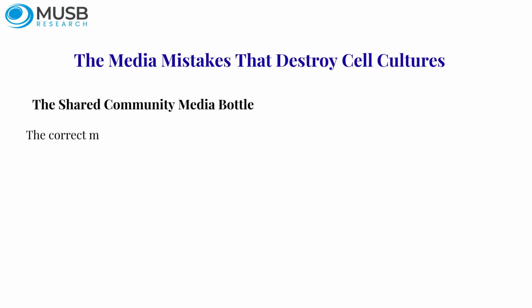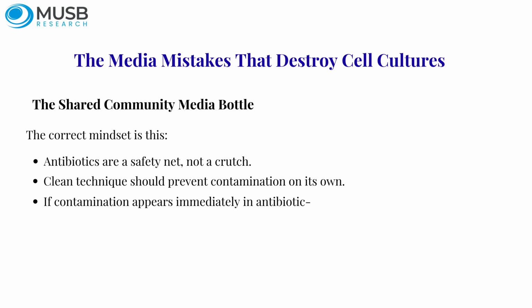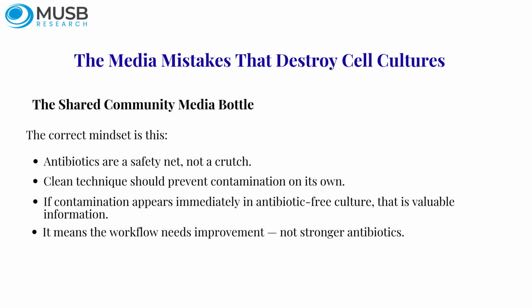The correct mindset is this: antibiotics are a safety net, not a crutch. In fact, many experienced cell culturists routinely work without antibiotics. Why? Because clean technique should prevent contamination on its own. If contamination appears immediately in antibiotic-free culture, that is valuable information. It means the workflow needs improvement, not stronger antibiotics.